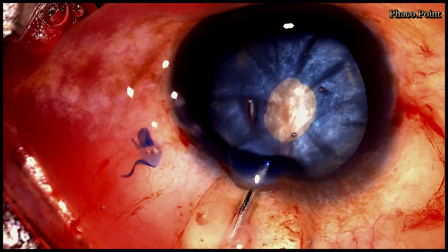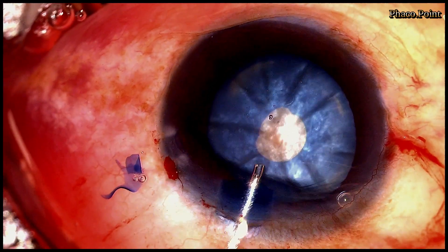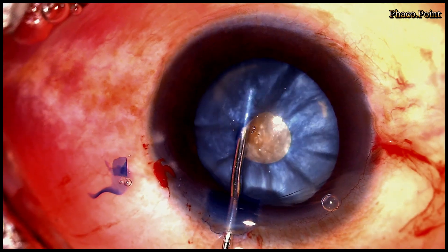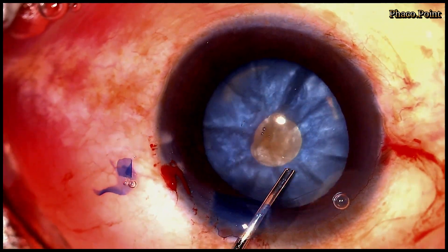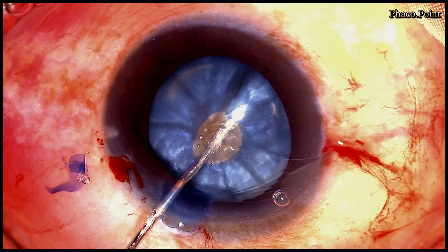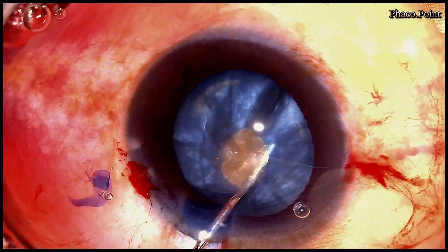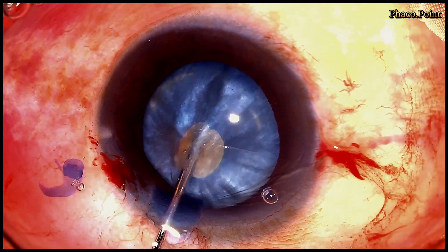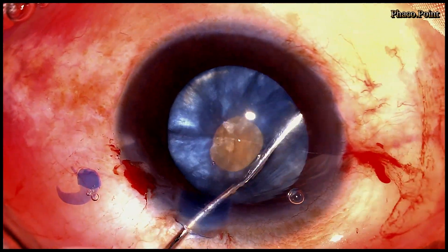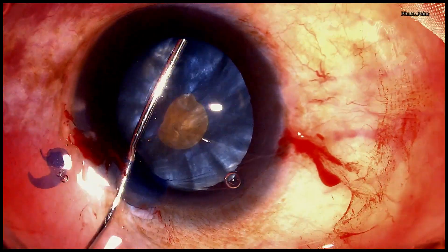Having achieved this, I now remove some of the viscoelastic from the anterior chamber and wash out some of the cortical material with a view to decompressing the capsular bag prior to making the second rhexis. Whilst washing out this cortical material, we must ensure we don't accidentally injure the anterior capsule, which would lead to a new challenge in managing this cataract through a torn anterior capsule.